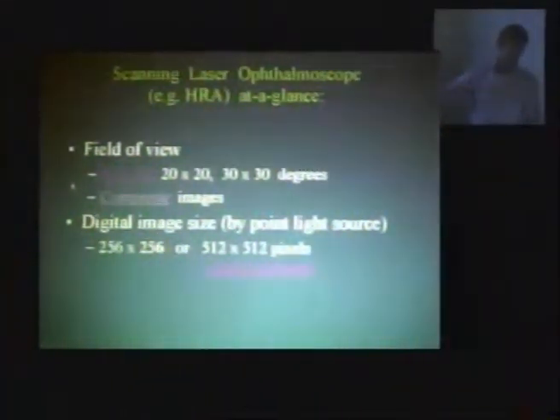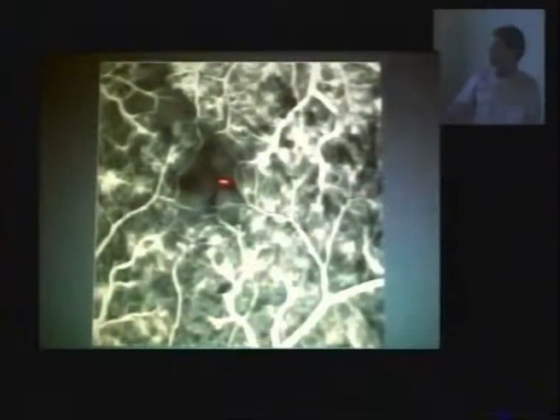Because what you say is digital image, you get high resolution with digital images. Like this, like we see before. With fundus camera, it's very difficult to get this. You see the cysts from the cystoid macular edema inside the macula. With fundus camera, it's very difficult.